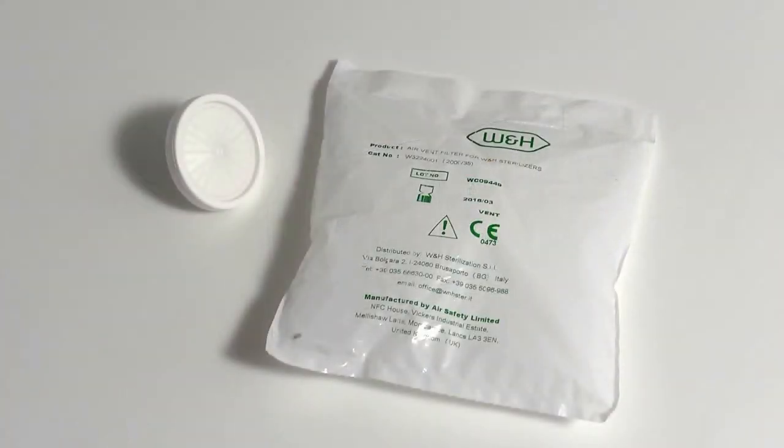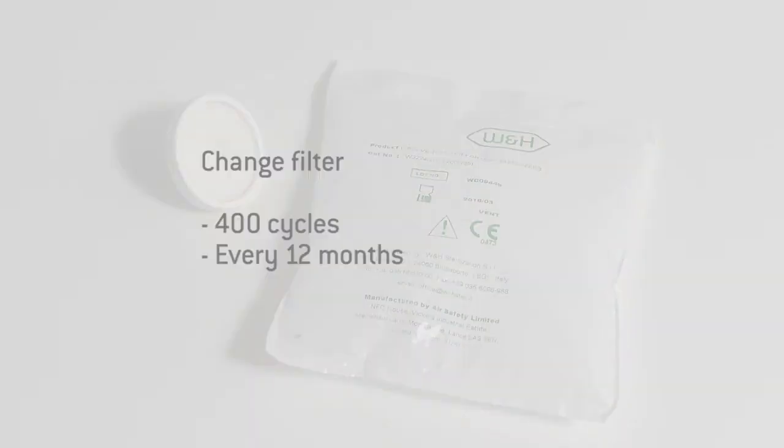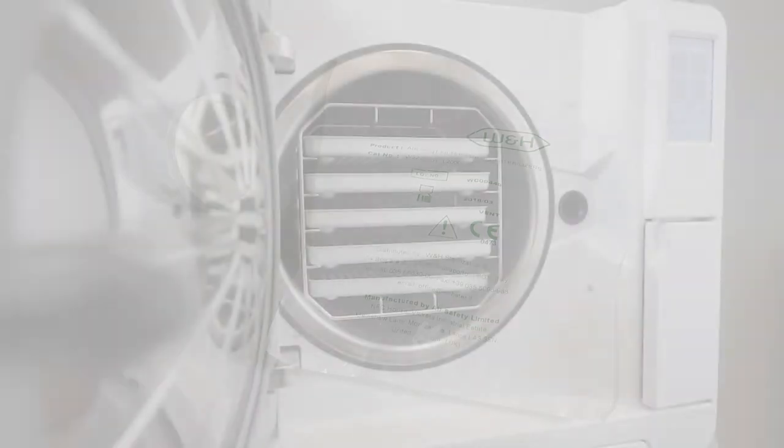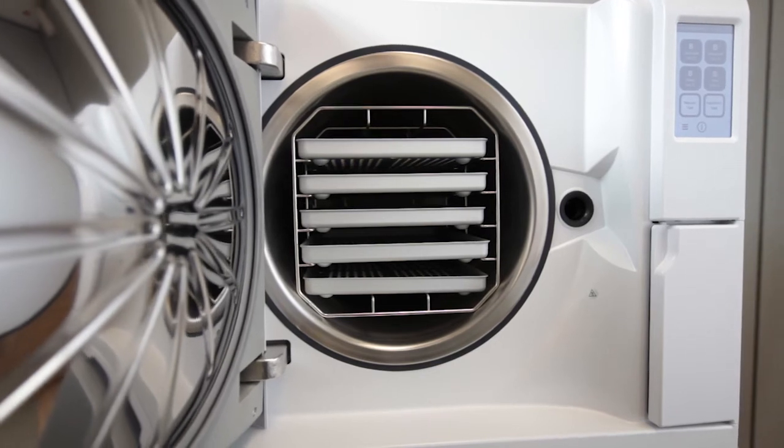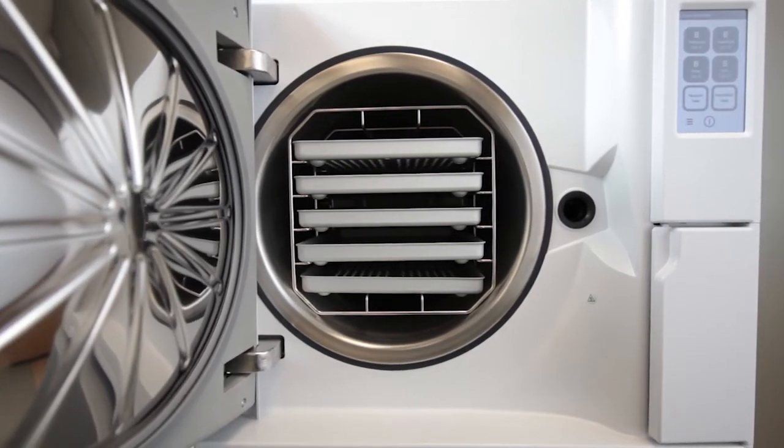The bacteriological filter should be replaced after 400 cycles or once a year, whichever comes first. By replacing the filter, you are ensuring that your sterilizer has a component that will filter the circulating air effectively.